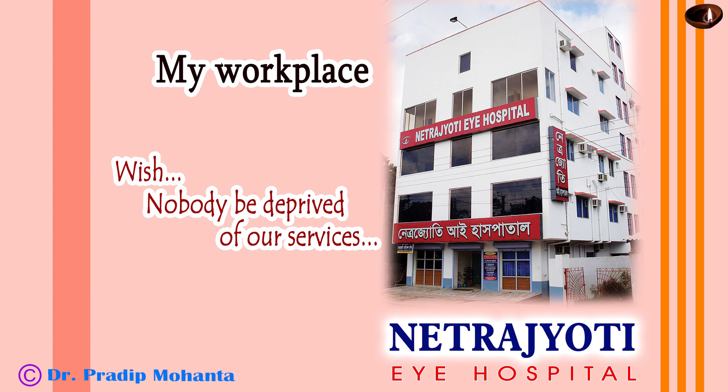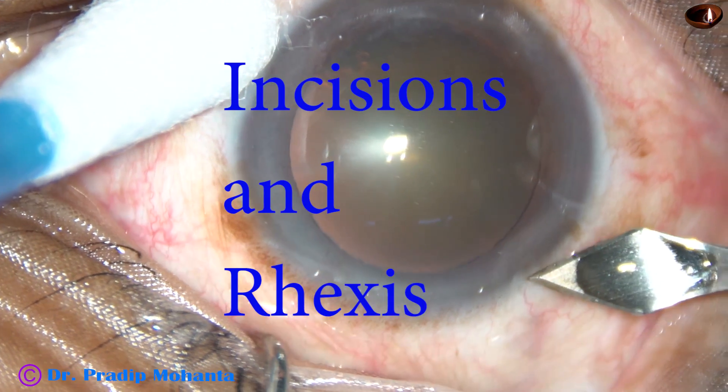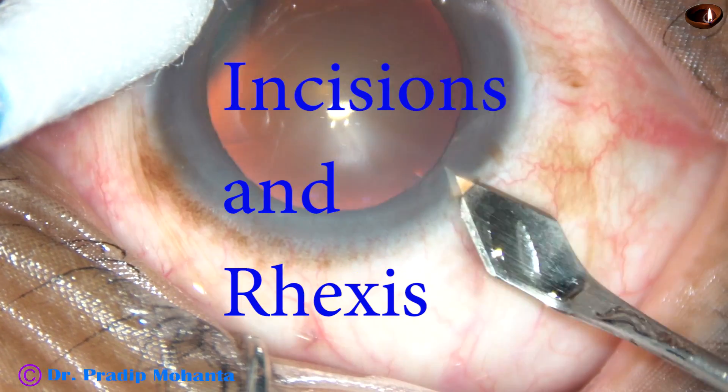Dear colleagues, welcome to my hospital at Ranaghat, West Bengal, India. In this video, I want to show incisions and rhexis.